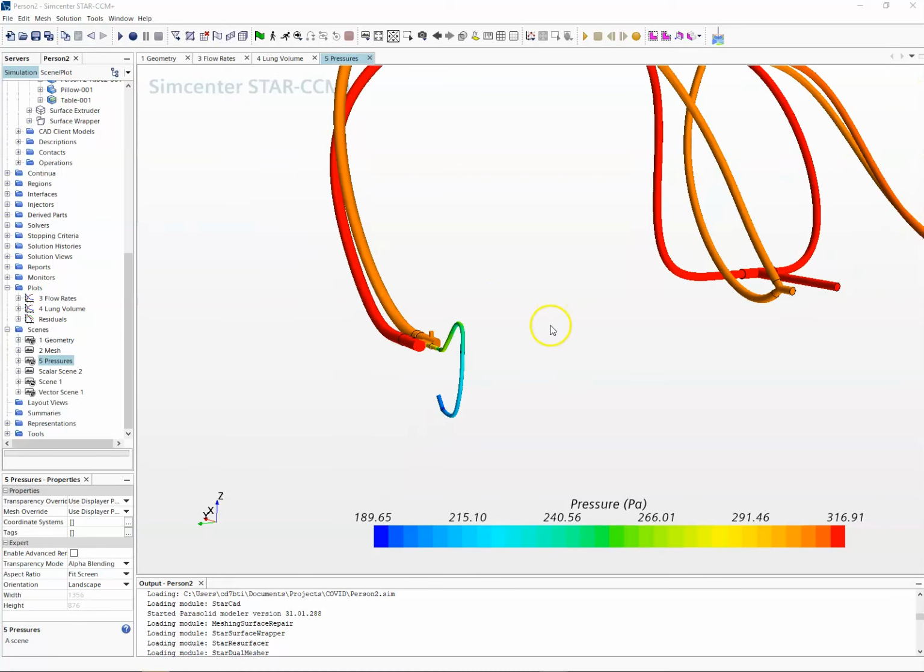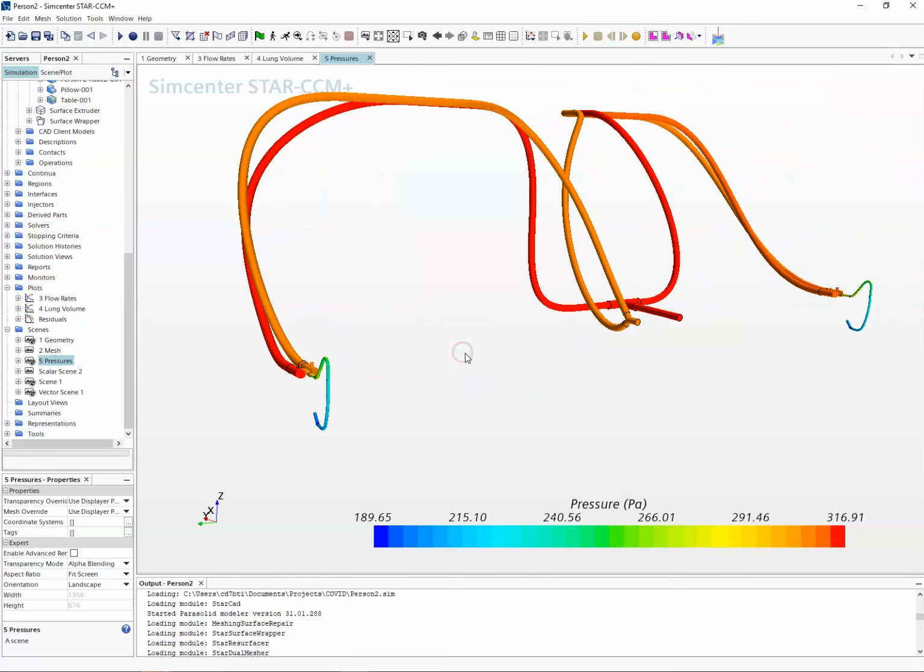So based on what we see in these data, it would appear that for two identical patients, bifurcating the ventilator disposables in order to support two simultaneous patients does not have obvious negative consequences. Of course, in the real world, patients are not identical, so further testing would be necessary before we fully understand the implications for safety.